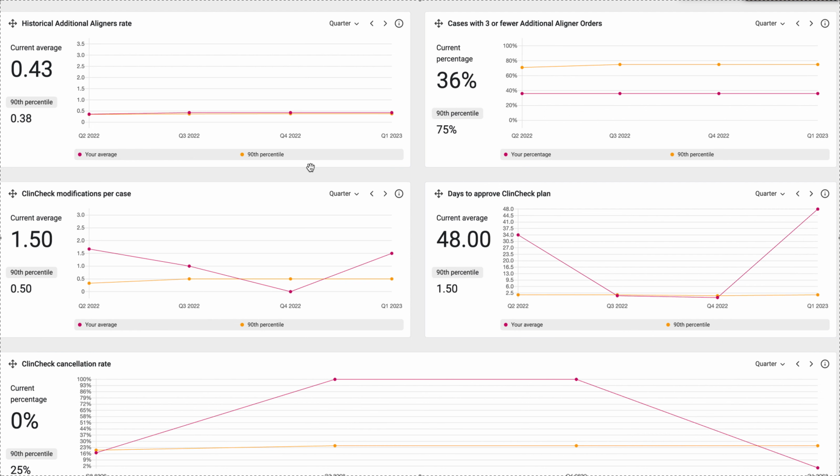Invisalign Virtual Care. If you've seen my latest video posted yesterday about their new virtual care with AI, I think it's a no-brainer. You should be using that or DM or in-hand dental, which is a nice happy medium. As far as I know, Invisalign Virtual Care has no cost for their dashboard. But you do need to pay for the retractors, which as of yesterday were $3 and change per patient, as well as they do have this little scan boxy thing, which they weren't selling on their store, and I don't know if it's required and how much that costs.